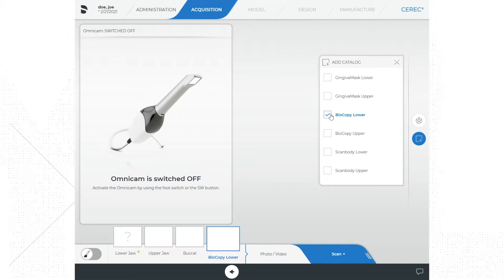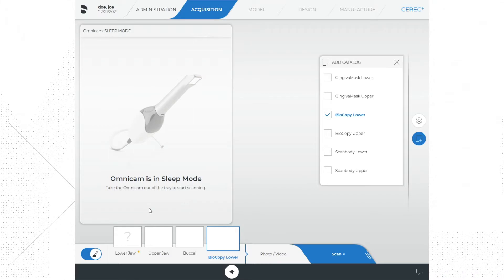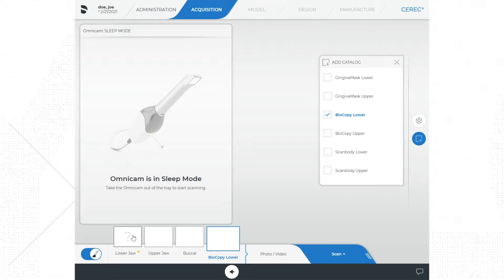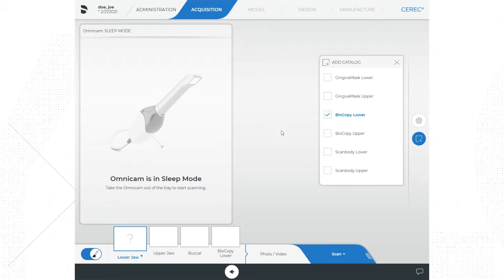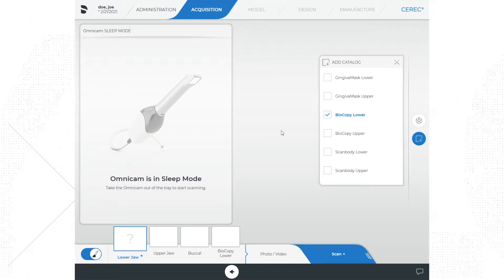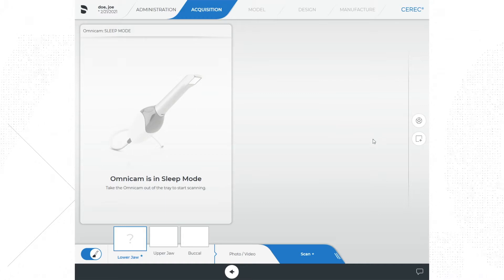I frequently like to add a bio copy of the jaw I plan to prep. For example, if we are prepping number 30, I would scan the jaw prior to the prep, then copy the lower jaw catalog and move a copy of that scan to the newly added biocopy lower catalog. I would then cut out the tooth I'm going to prep on the lower jaw catalog and rescan the prep. Later in the design phase I can turn on the biocopy of the lower jaw and actually see if my restoration is similar to what the patient originally started with.